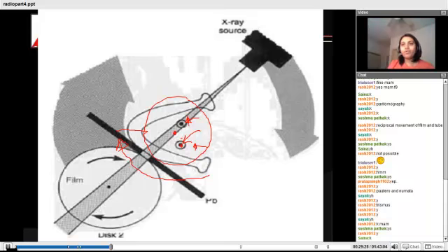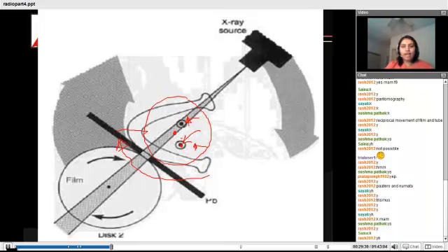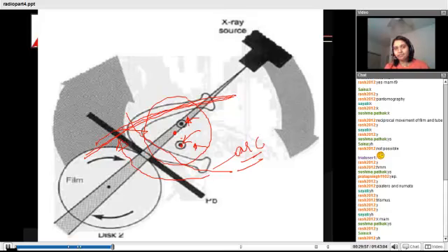Why we are doing this is that we are trying to treat one half of the mandible as one arc, and we are using a center of rotation that best suits this particular side of the mandible, isn't it? So that it becomes a smooth movement, at least while recording one half of the mandible. And again, the second time, we take this particular half as a reference and select the center of rotation depending on this half.